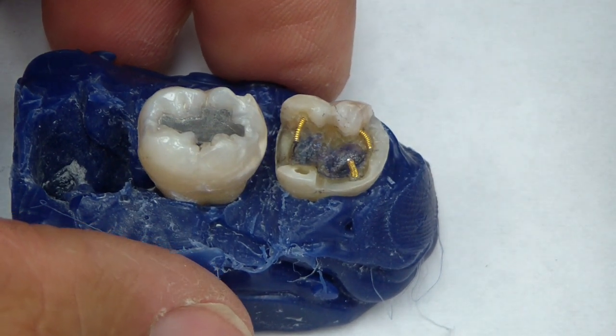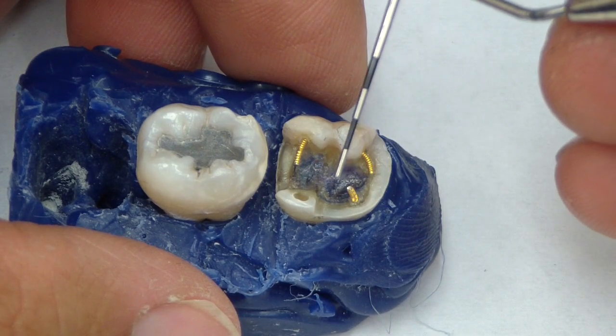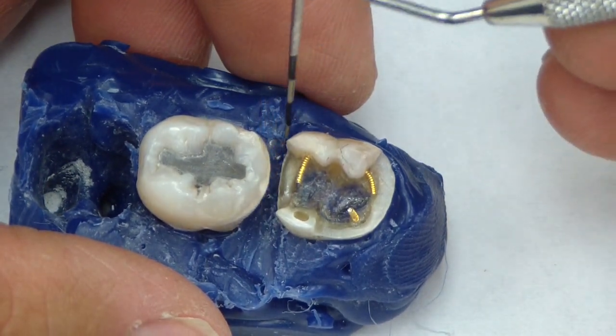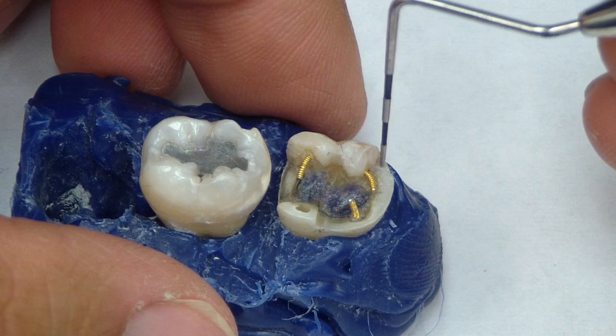Hey folks, Ashley at LittleThingsDentistry.com. Here's a video discussing some of the retentive features of a complex amalgam preparation of a mandibular first molar. Disregard the second molar — I'm just using that for contour. We're discussing retentive features that can be placed into a complex amalgam.